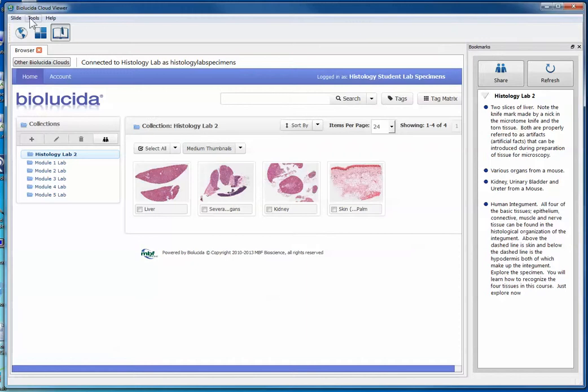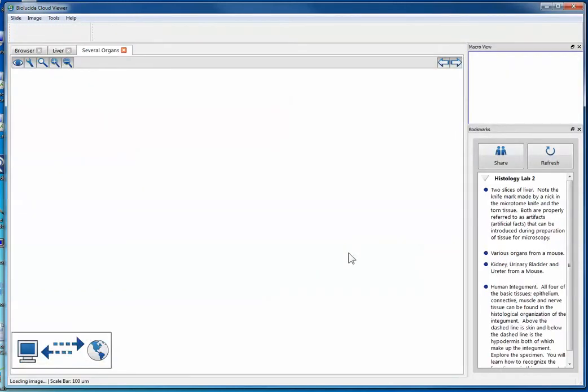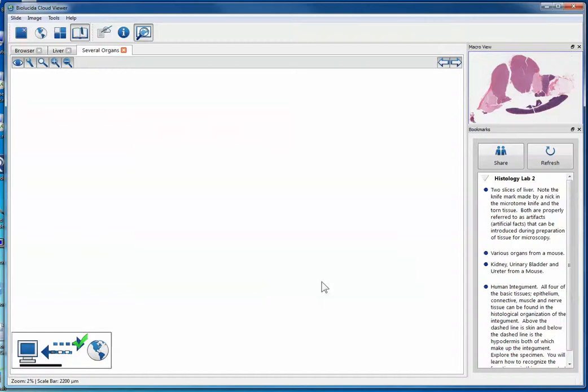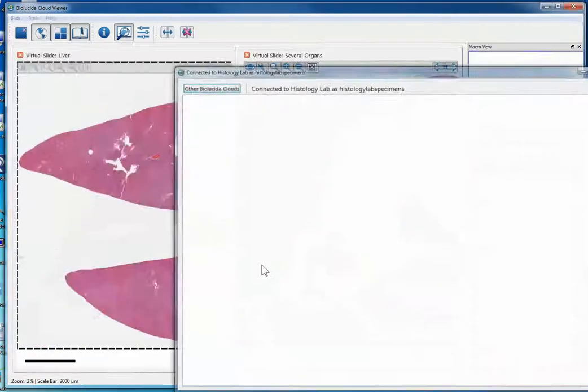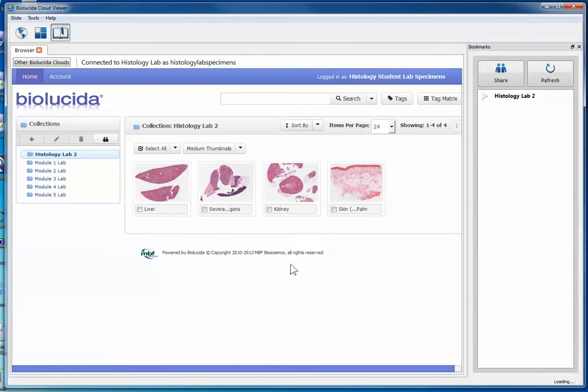There is one other tool I'll demonstrate in another video, so I'm going to do it here. Like if you chose two specimens to open and wanted to compare the two, then you should be able to open both of these specimens, and they should pop up here both at the same time. And then when I click on this grid, I'm going to close this to kind of pause this and get this to work.